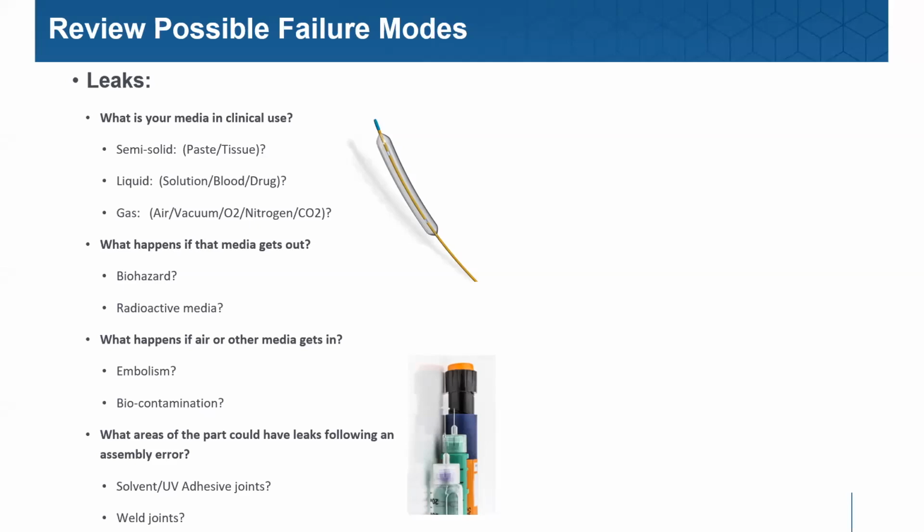Those are a piece of cake to test. We don't even have to do anything special. They're nice, low volume, very easy to pick up leaks. Now, let's look at the other end of the scale.